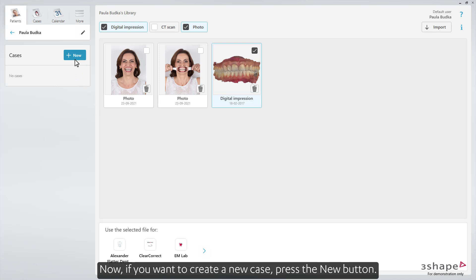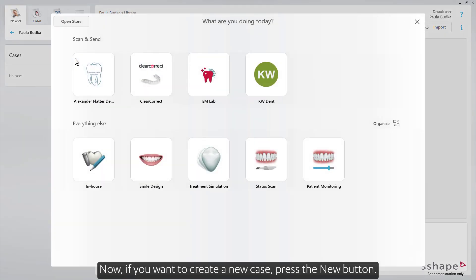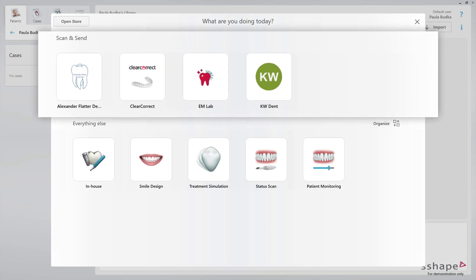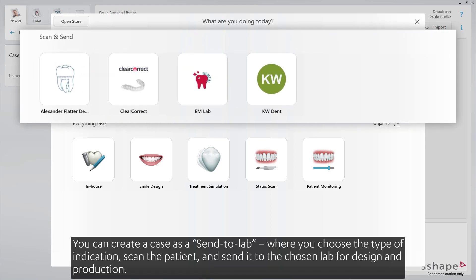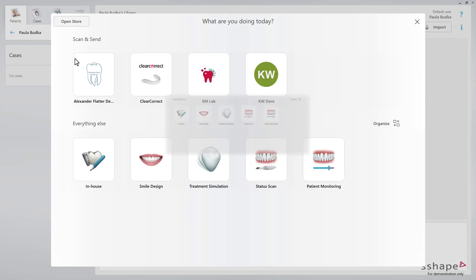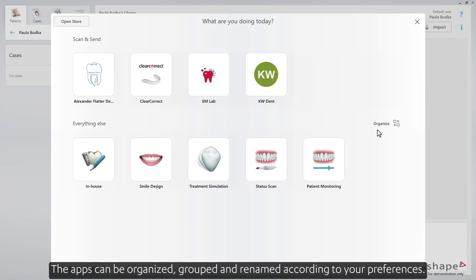Now if you want to create a new case, press the New button. The new dialog window will open. You can create a case as a sent to lab, where you choose the type of indication, scan the patient and send it to the chosen lab for design and production. Or use the app center and decide if you want to make an in-house production, create a smile design case, or make a status scan for a study model. The apps can be organized, grouped, and renamed according to your preferences.